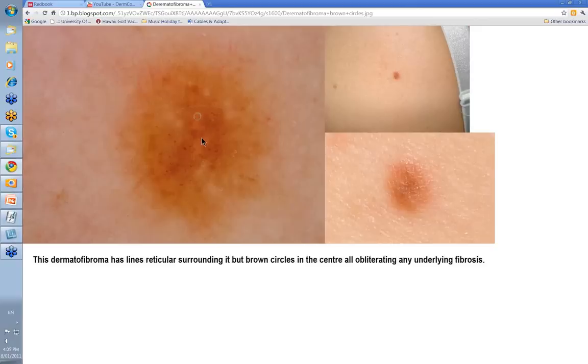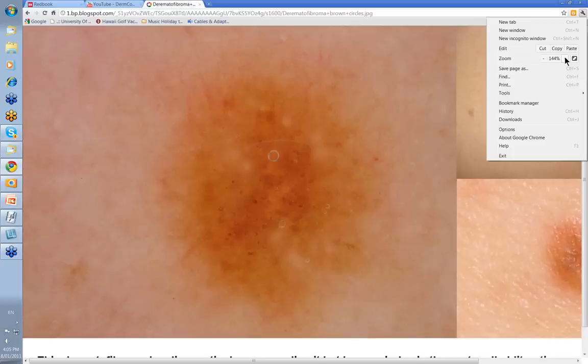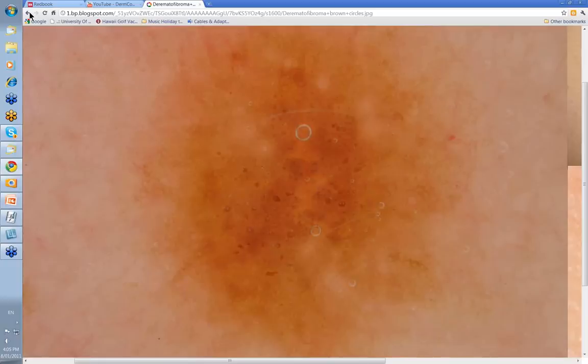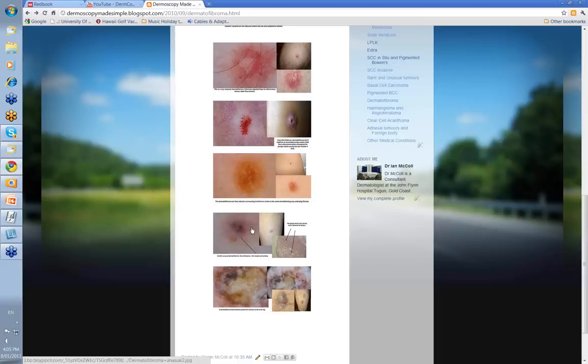Here's a dermatofibroma where you've hardly got any white structure in this area, and it's basically got lines reticular surrounding it. There are also some brown circles in the center — let's make that a little bit bigger. What I was taking to be brown circles, some of them almost look filled in as if they're brown clods, and you can get brown clods in the center of a dermatofibroma as well. You've still got your lines reticular around the outside. I think they're more brown clods than brown circles if you actually look at them.